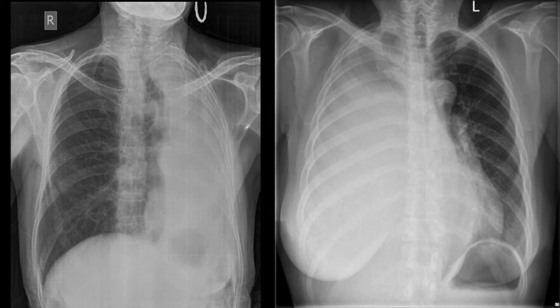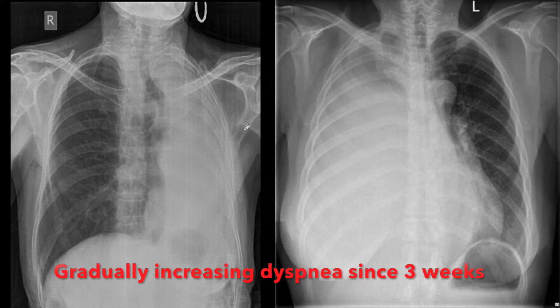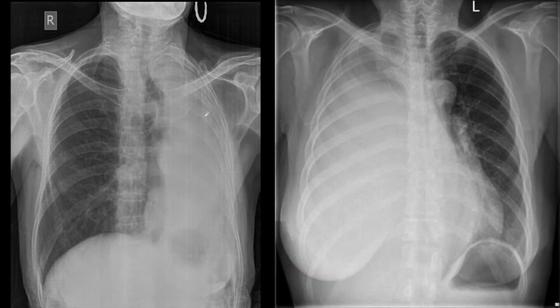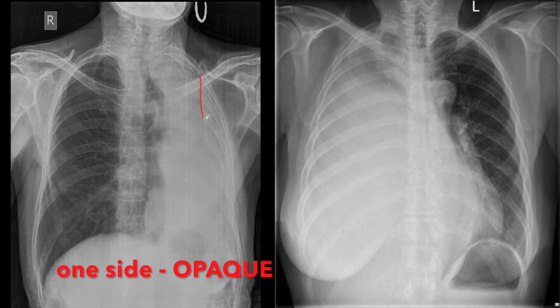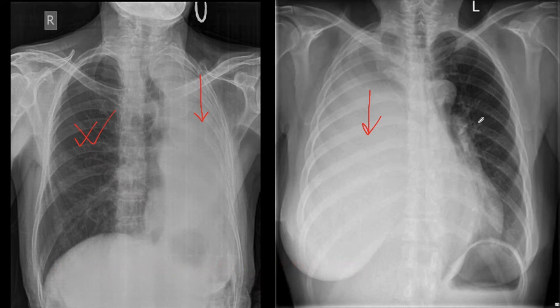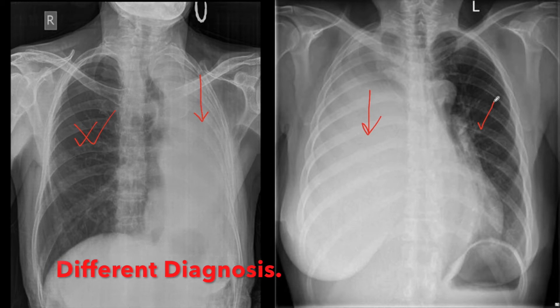Look at these two X-rays. Both of these patients presented to the emergency room with gradually increasing dyspnea since 3 weeks. In both these patients, you can see that one side of the thorax is opaque and another side of the thorax is well aerated. Both these patients have different diagnoses which can be made by looking at the X-ray. Can you come to the diagnosis?